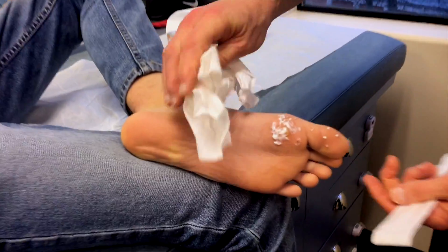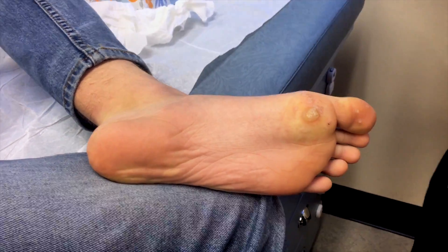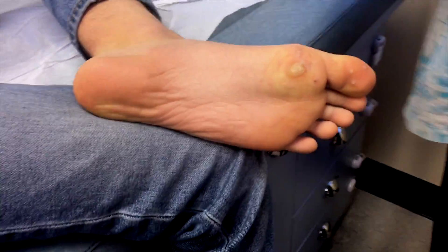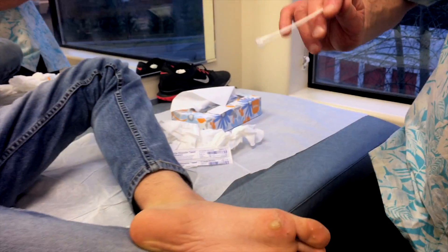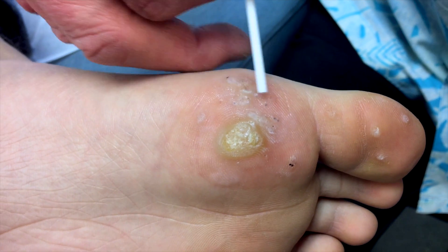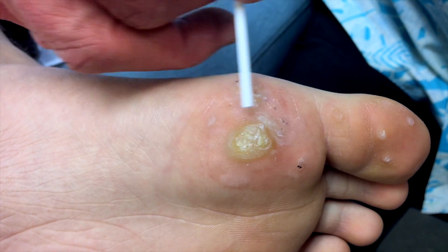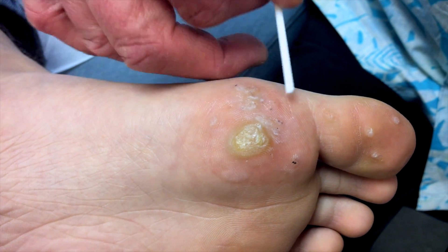So we'll just put your leg like that. I'm going to wipe off this numbing cream. Whoa, look at that — you have a family of warts. Liquid nitrogen is very cold. Folks, you can see here, we've got a big old cluster of warts. Some little ones — that's probably the daddy wart, and then mommy's, maybe they're together. We've got all these baby warts.